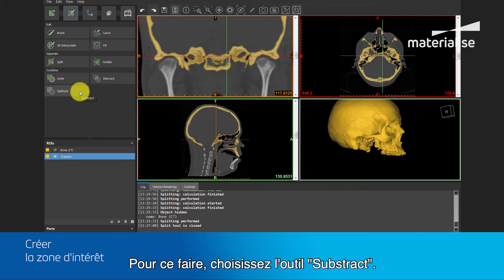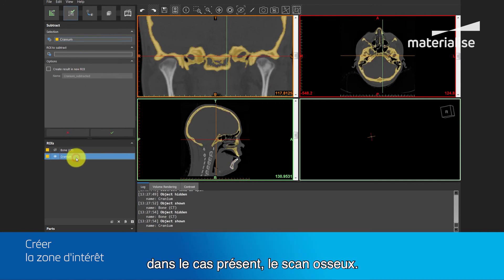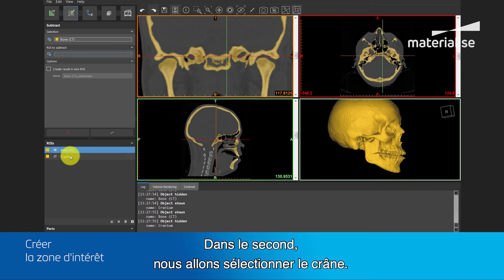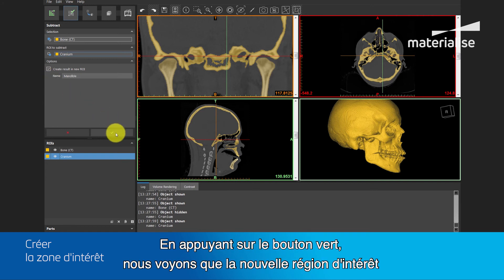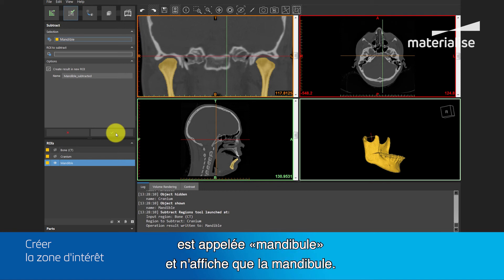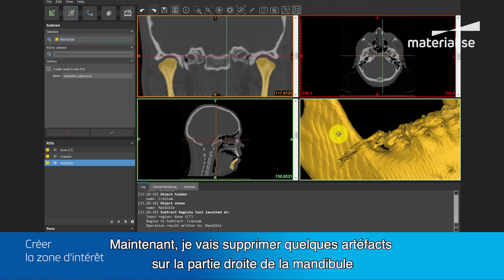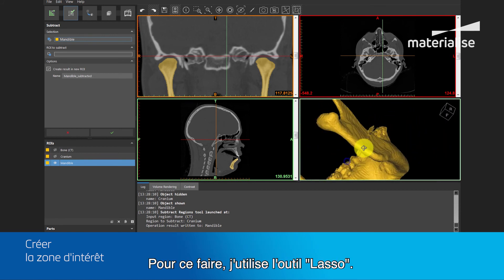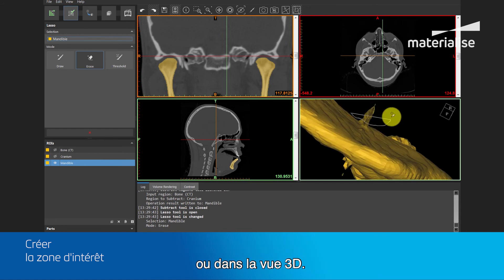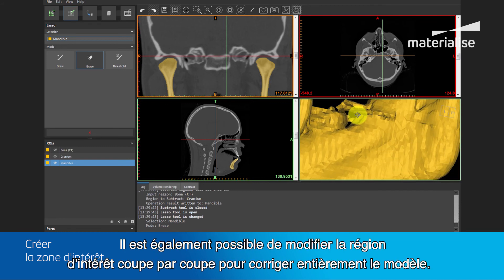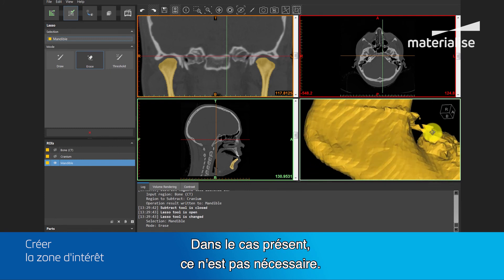To do this, choose the subtract tool. In the first selection, select the largest region of interest, in this case the bone CT. In the second, we'll select the cranium, and I will check the box 'create new region of interest' and rename it as mandible. By pressing the green button, you'll see that the new region of interest will appear called mandible, and only display the mandible. Now I will remove some of the scatter on the right side of the mandible near the second molar using the lasso tool. With this tool, we can edit the ROI directly on the images or in the 3D viewport. It is also possible to edit the region of interest slice-per-slice to fully clean up the model, however for the current application, this is not necessary.